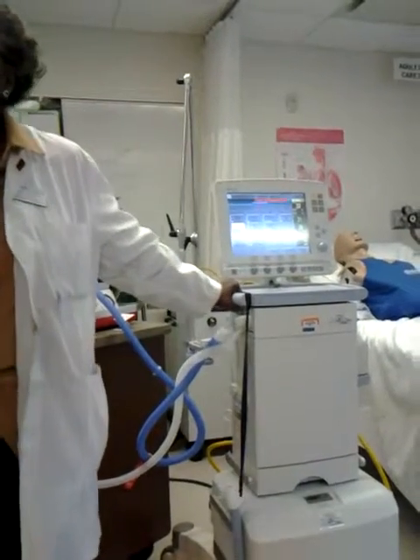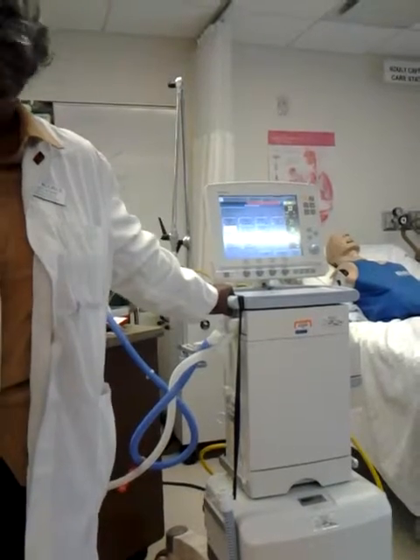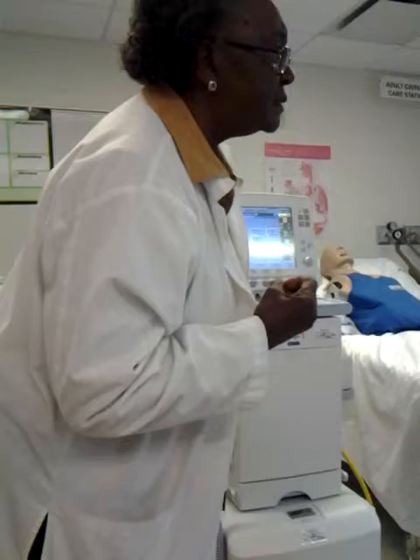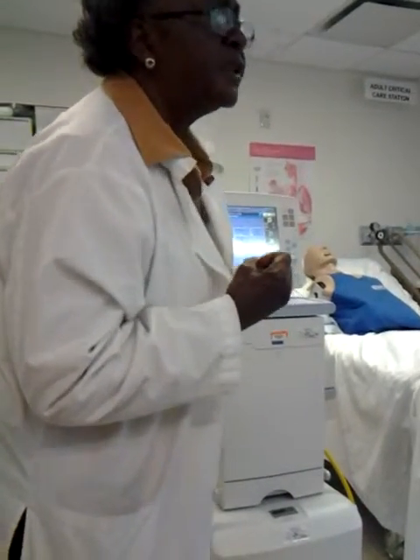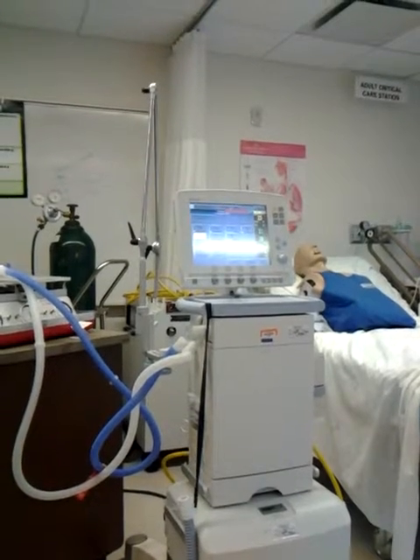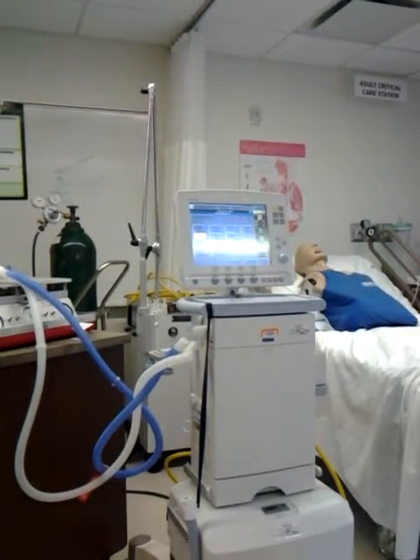It keeps the alveoli open. No. What did you say? No, I'm sorry? Pressure support. What does pressure support do? It helps with the tidal volume. Okay, it helps with the tidal volume. It augments the spontaneous tidal volume, but what else does it do?